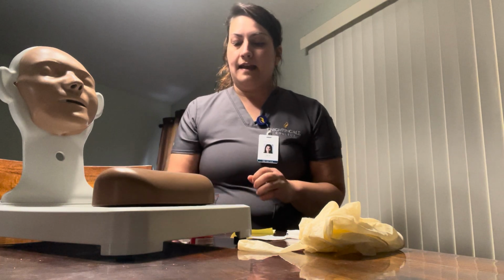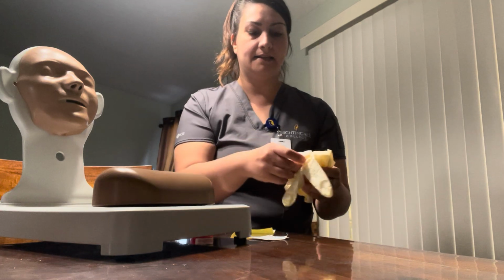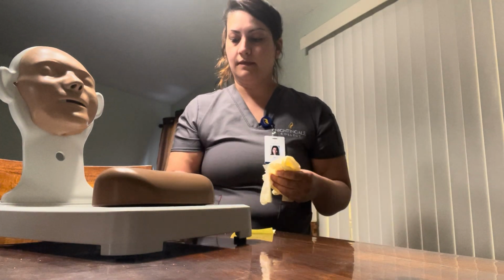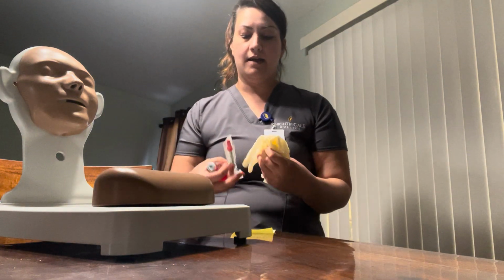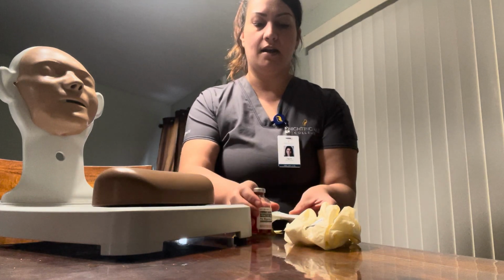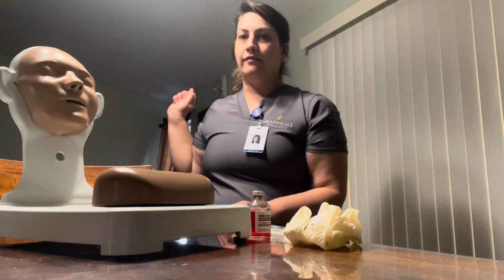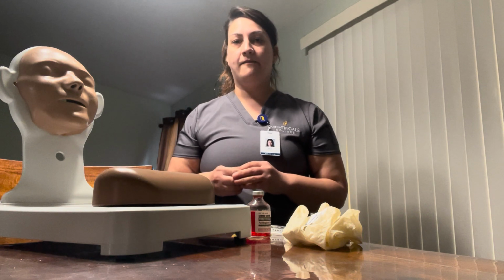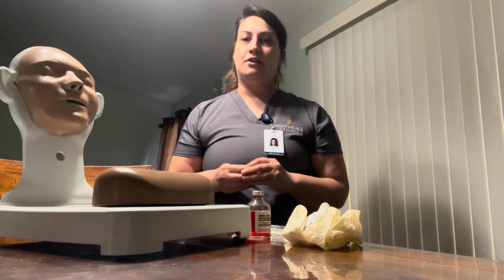Okay, and then next I'm going to gather all my supplies. And I will knock and enter into the patient's room. I will place my equipment on a dry, clean surface. I will close my door for privacy. I want to make sure that there are no family members present for HIPAA violation. And I will go in and introduce myself.